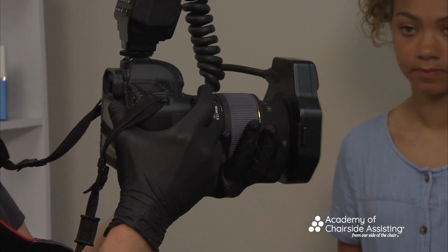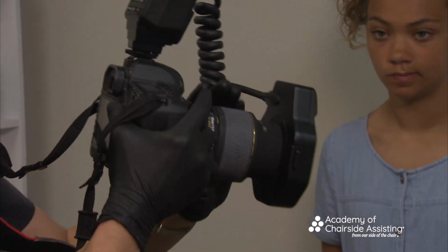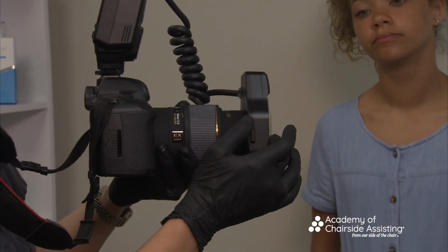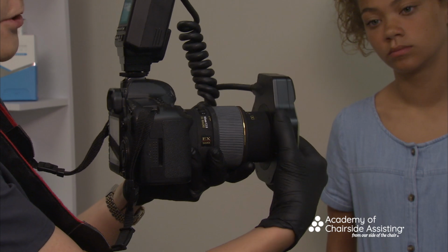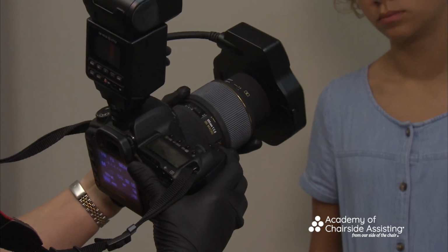Some people like to actually hold it here, but I always found that I kind of moved it a little bit, and I don't want to do that. So I like to take it and really grasp it. Making sure though, if you're using a lens and also a ring flash, that this is straight up, not turned to the side. You see that? Straight up.